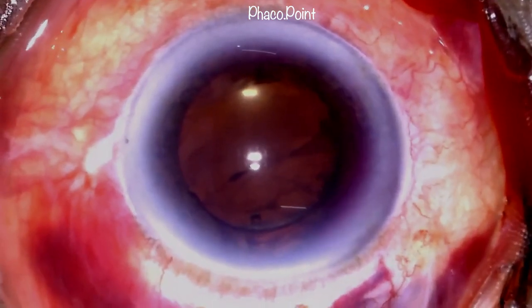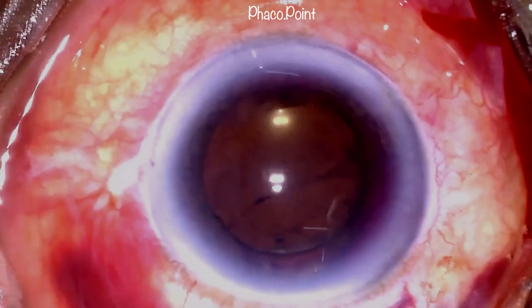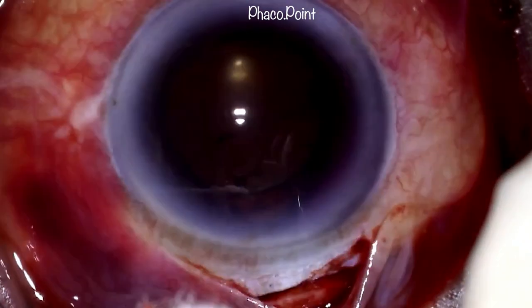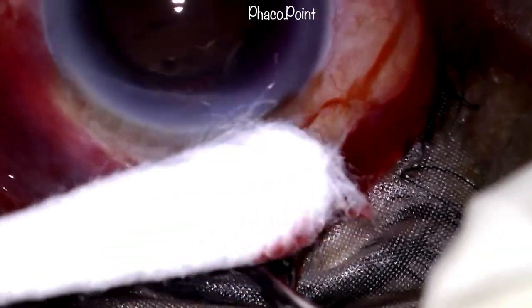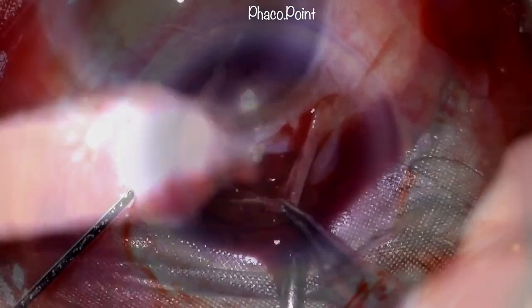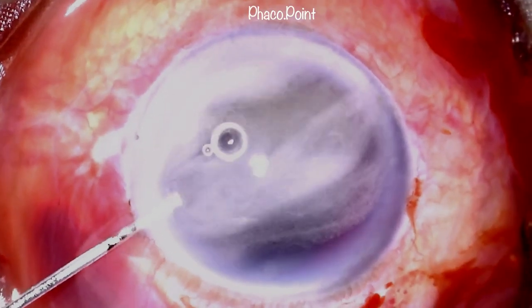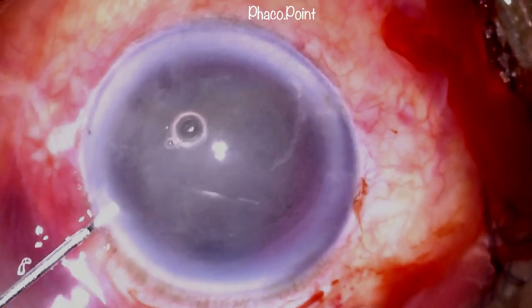The IOL, however, appears to be stable, and at this point I can't really tell whether or not there is a posterior capsular rupture or a zonular dialysis. We start with examining the SICS wound for evidence of any prolapsed iris or prolapsed vitreous. Next, I introduce triamcinolone acetonide into the anterior chamber to delineate the disturbed vitreous.